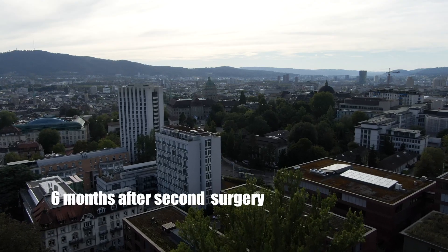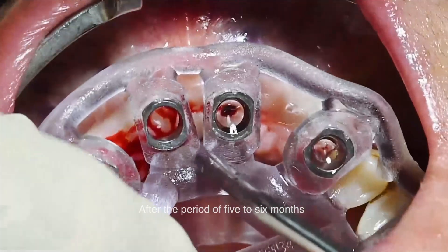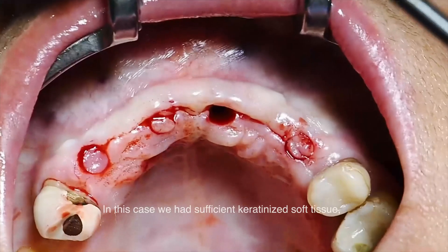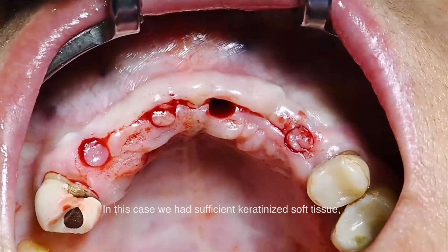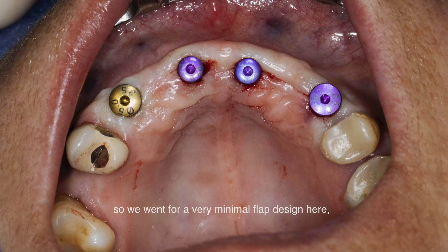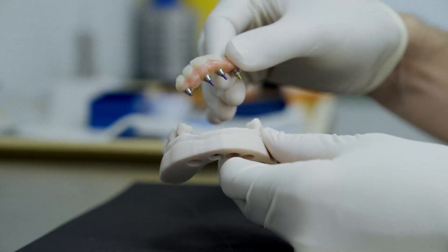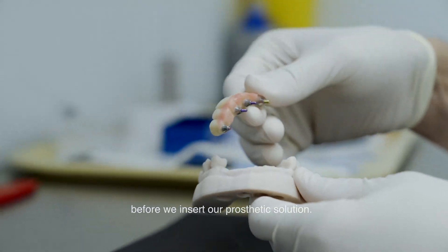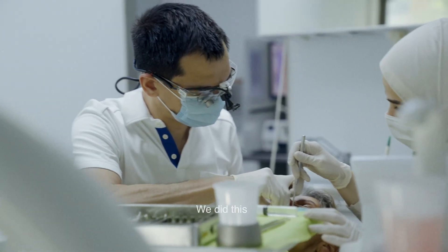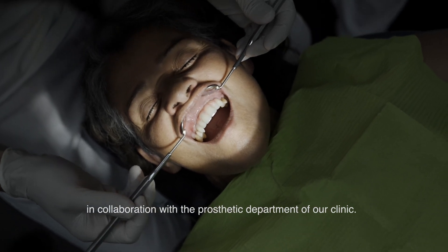After five to six months we perform the abutment connection. In this case there is sufficient keratinized tissue surrounding the implants, so we used a very minimal flap design before inserting the final prosthetic solution, completed here in collaboration with the prosthetic department of our clinic.